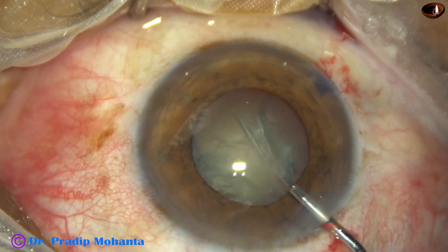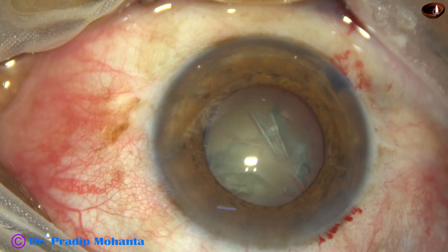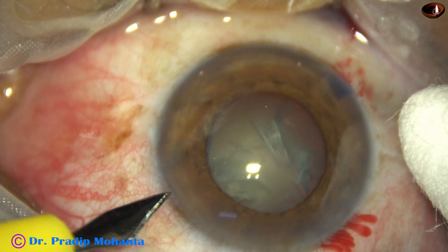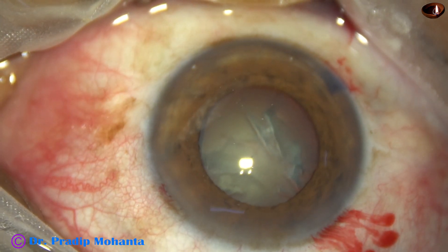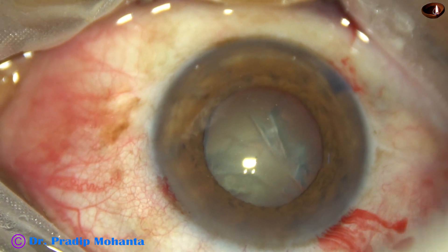The nuclear sclerosis in this case is about grade 3. This is a side port on the left side of the main incision. In this case, I am going to try pre-chopping the nucleus.